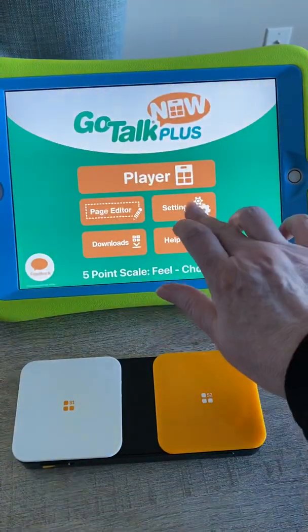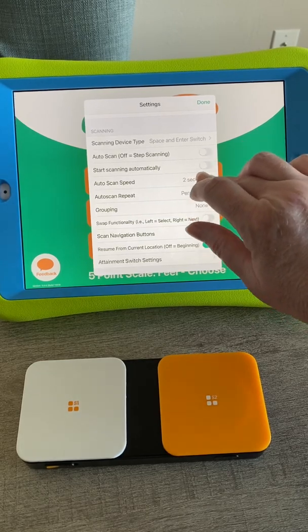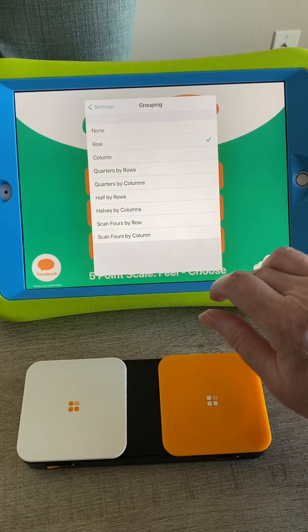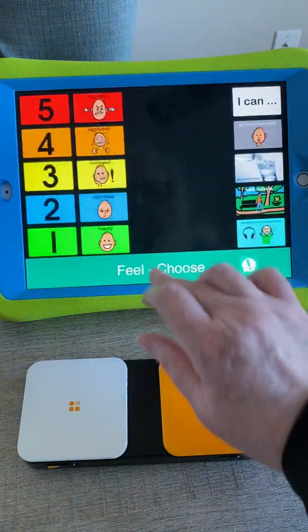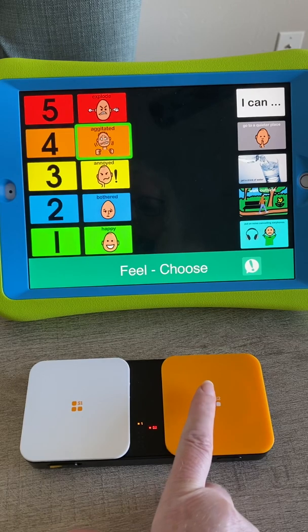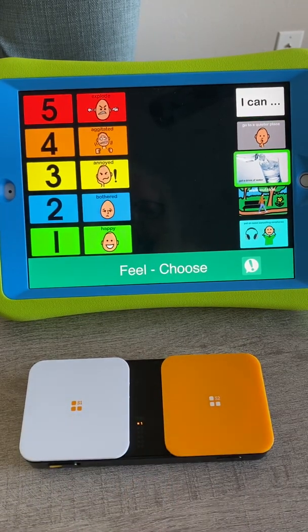And then you can go back over here. Let's do grouping — if I wanted to do row or column and then row scanning, that's going to be quicker. So I know it's something here. It says 'I'm agitated.' Get a drink of water.